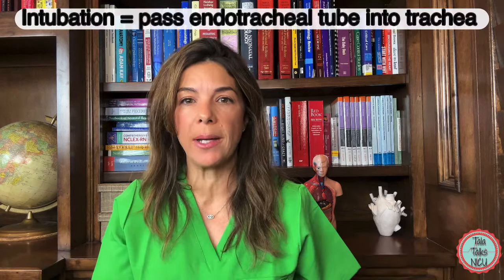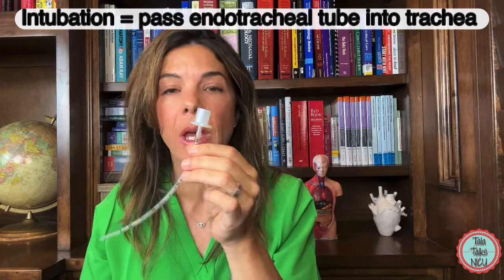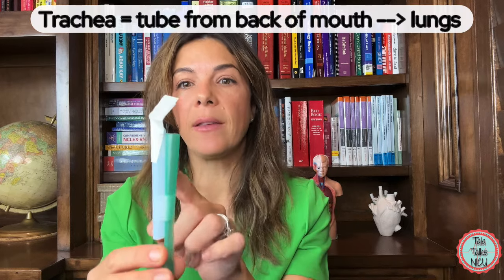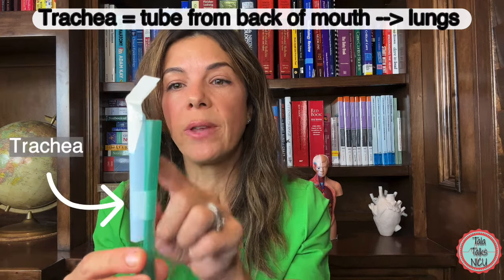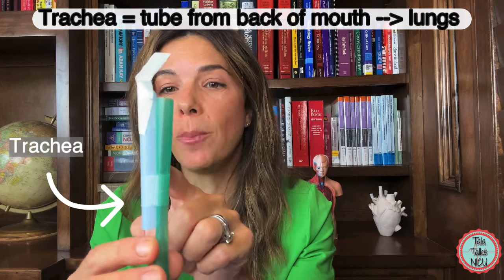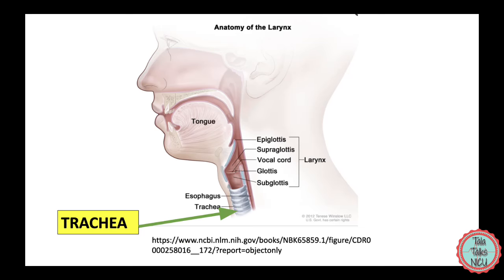When we're intubating, we're trying to pass an endotracheal tube down into the lungs — through the vocal cords and down the trachea. The trachea is one of the tubes that goes down from the back of the mouth, or the oropharynx. It's the blue tube in this scenario, and it goes down into the lungs. That's where we're trying to pass the endotracheal tube.